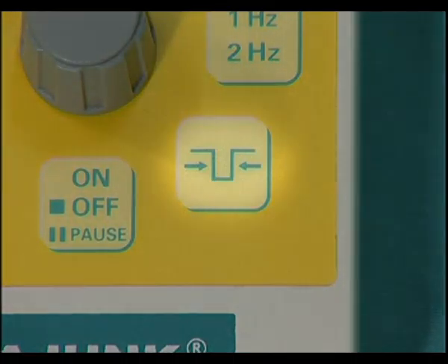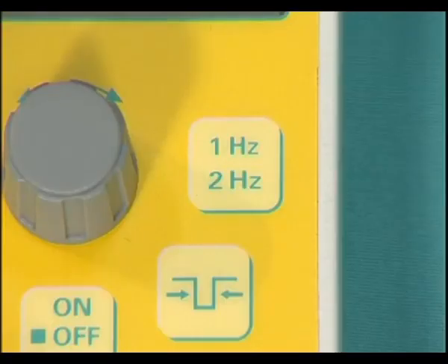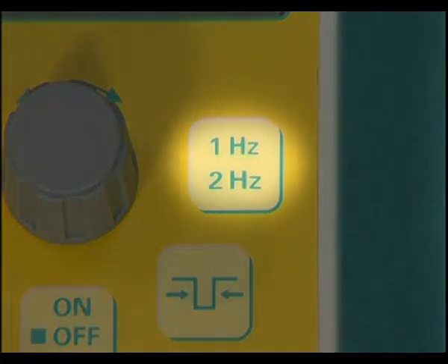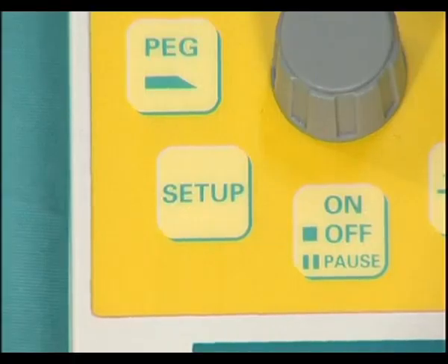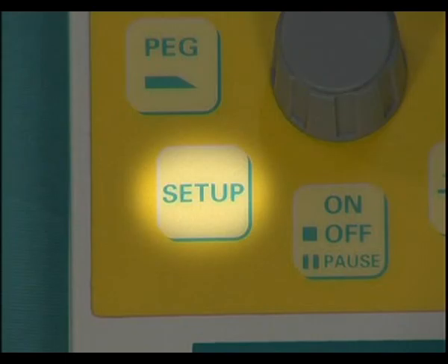The pulse width can be changed by pressing this button and then by turning the grey knob either clockwise or anti-clockwise. You can choose from between 0.05 milliseconds and 1 millisecond. The frequency can be altered by pressing this button, either 1 or 2 Hz. You can pre-program the sensor and set the volume of the audible bleeps to your individual preference by using this Setup button and following the instructions in the handbook supplied with the sensor.